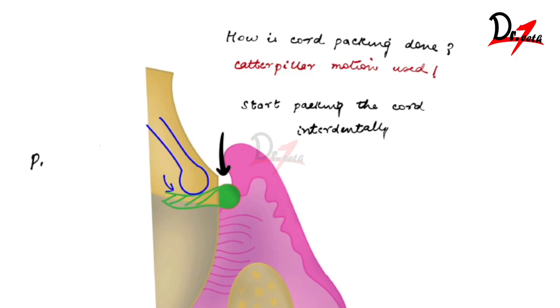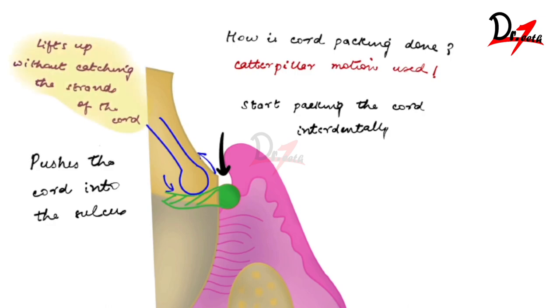So one side of the cord you will push the cord in with the help of the cord packer, and while you push, the other side lifts up without catching the strands of the cord. This is the caterpillar motion we were talking about.